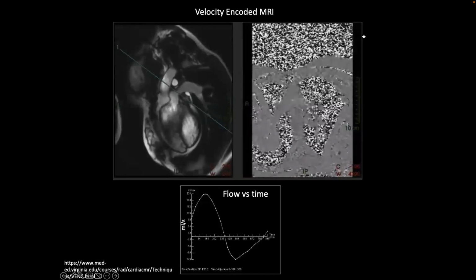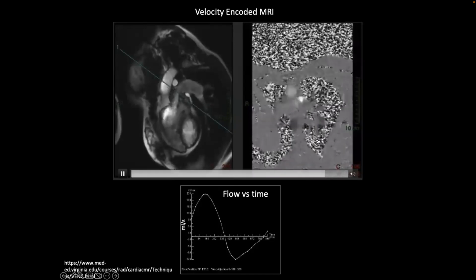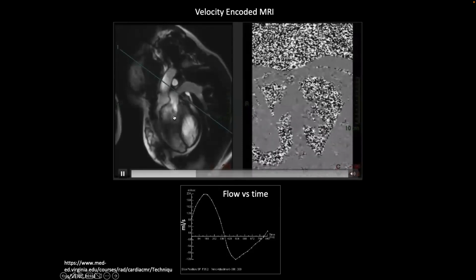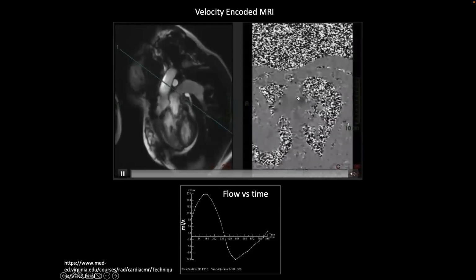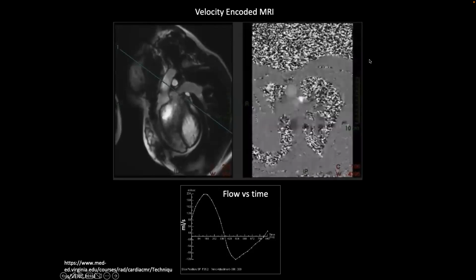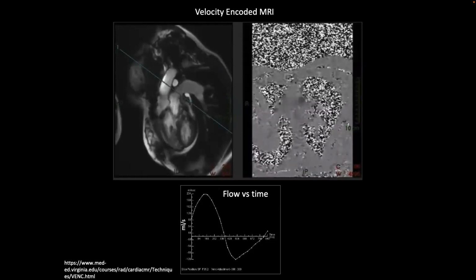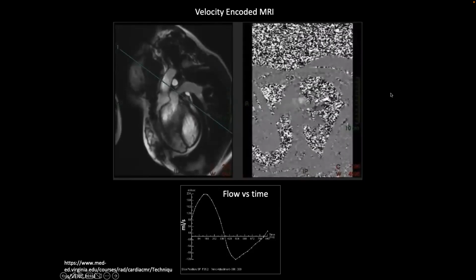And so here, this image is a raw image of phase angle. So a magnitude image looks like this. In fact, these aren't the same slice. I think this line here shows this slice. So look at the air. This is air back here, and this white noise up top here is air. So the phase angle from the magnetization vector in the air is random, because the X and the Y components are just noise, and so you just get totally random phase angles. And so that's what that looks like.